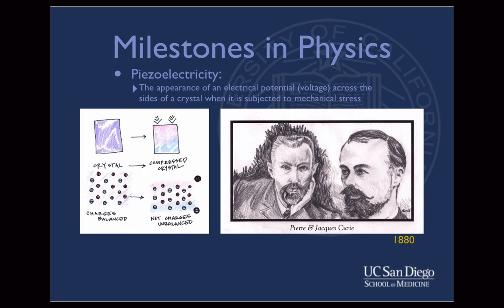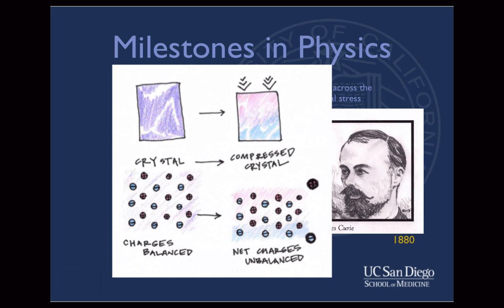The Curie brothers, pictured on the right, first demonstrated piezoelectricity in 1880 using a quartz electrometer. Piezoelectricity refers to the appearance of an electric potential when a crystal is compressed. This is an inherent property of certain solid materials, such as quartz. This concept is illustrated in this diagram.